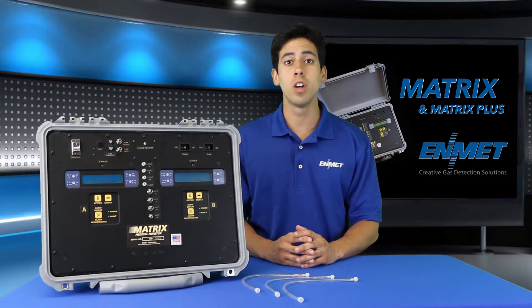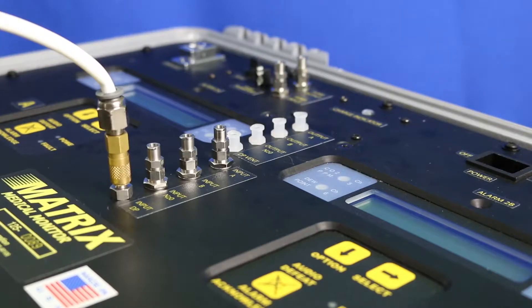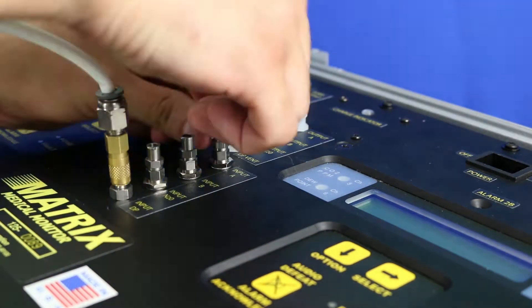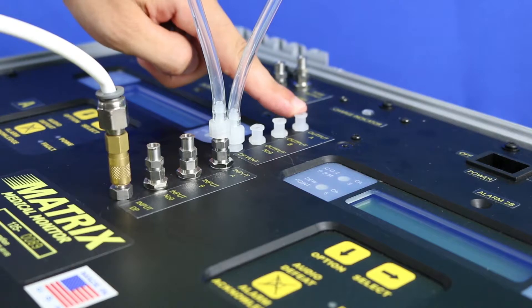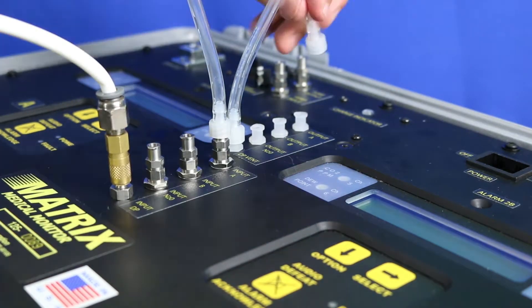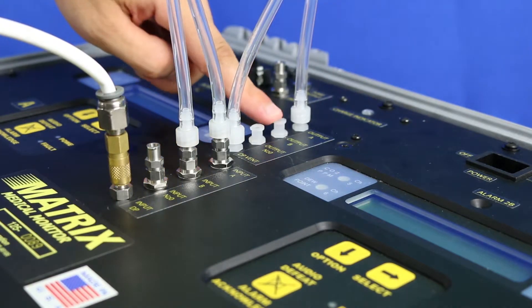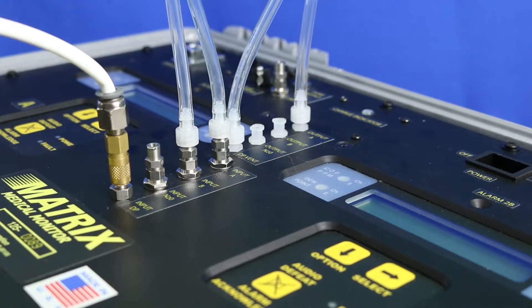Using one of the small jumper hoses, connect DP vent to input A. Next you'll need to connect a second jumper hose from output A to input B. Finally, connect a third and final jumper hose from output B to input N2O.